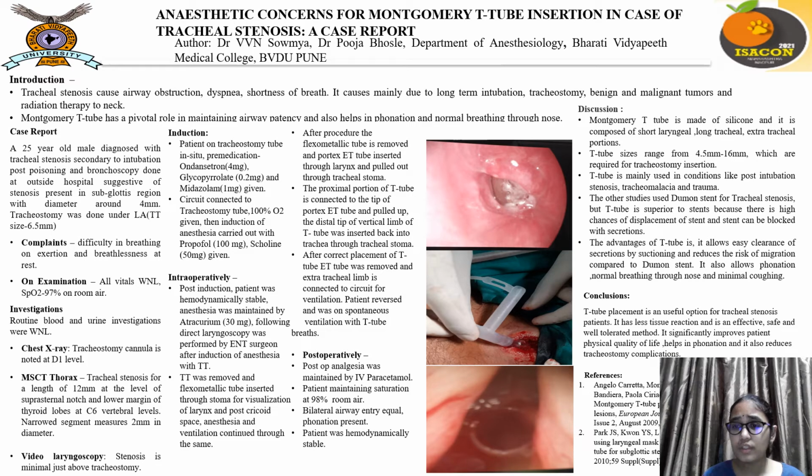The advantages of the T-tube are that it allows easy clearance of secretions by suctioning and reduces the risk of migration compared to the Dumon stent. It also allows phonation and normal breathing through the nose and minimal coughing.